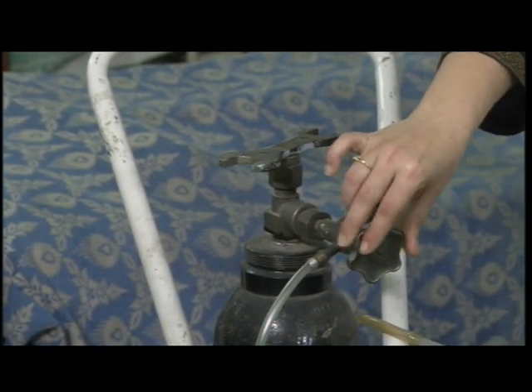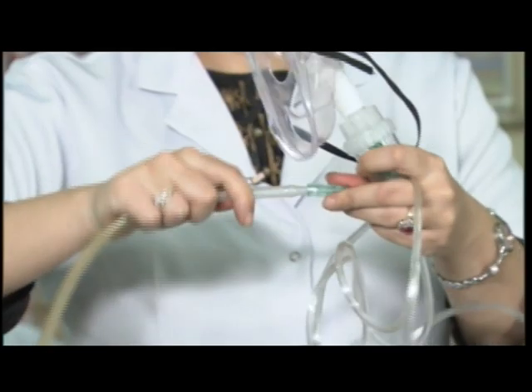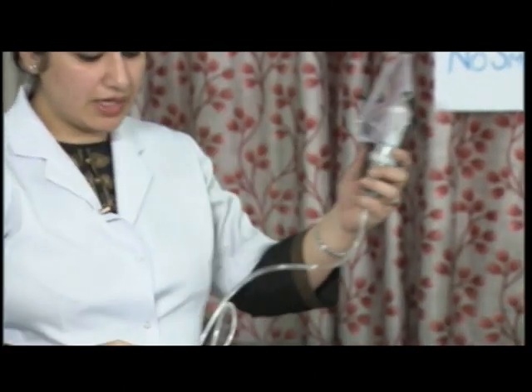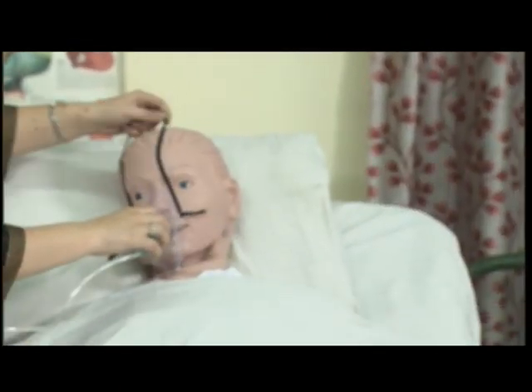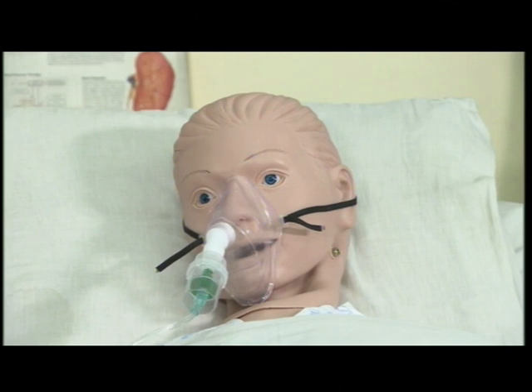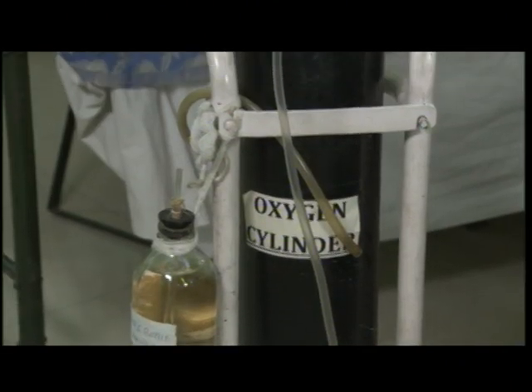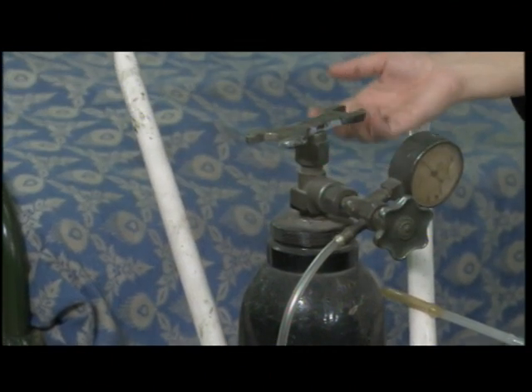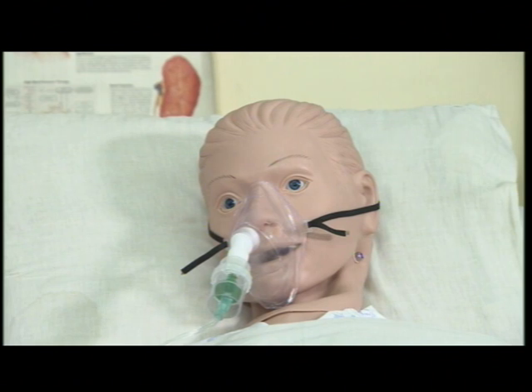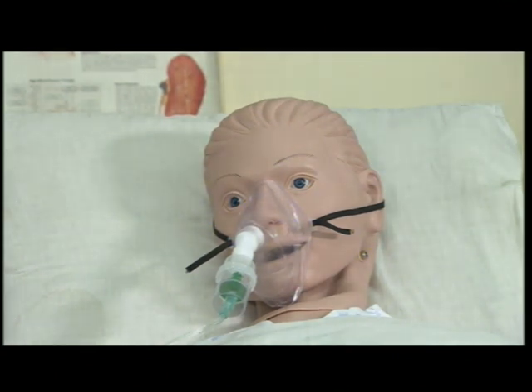All connections should be well fitted so that there is no leakage and no danger of combustion. We will attach the mask and then explain the procedure to the patient. We will release the pressure, check the prescribed rate, and check whether the oxygen fumes are coming to the patient or not. We can also ask the patient whether they are able to inhale the oxygen.